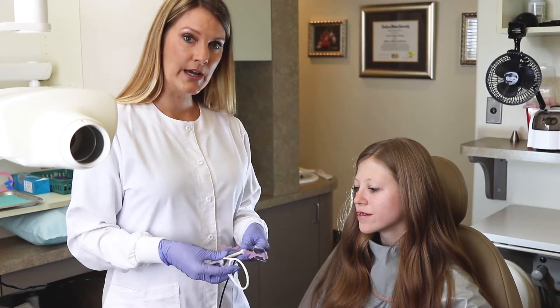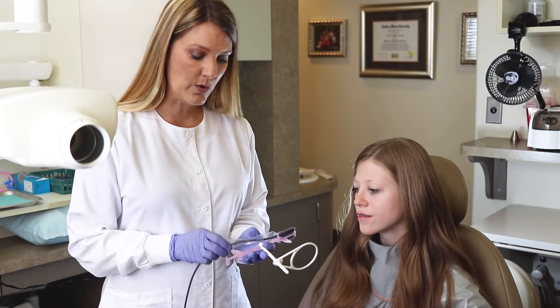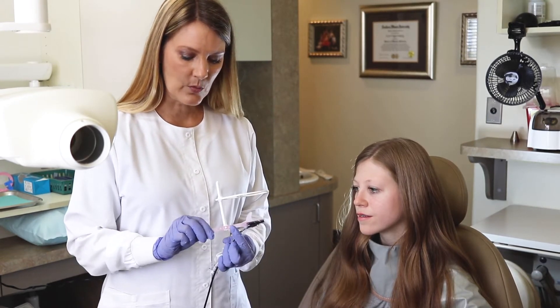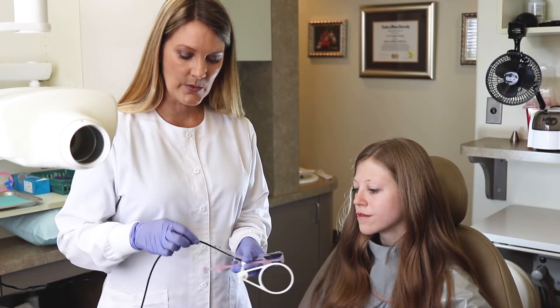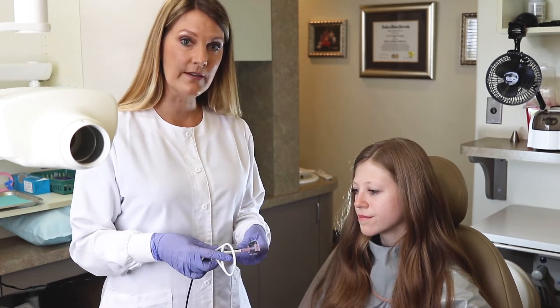We've already showed you how to assemble this, but I would like to show you where to actually put your cord. We have cord clips — one on the bottom, one on the top on either side of the rod, and we also have one on the ring. Go ahead and place that; it helps keep your cord out of the way while you're doing a full FMX.